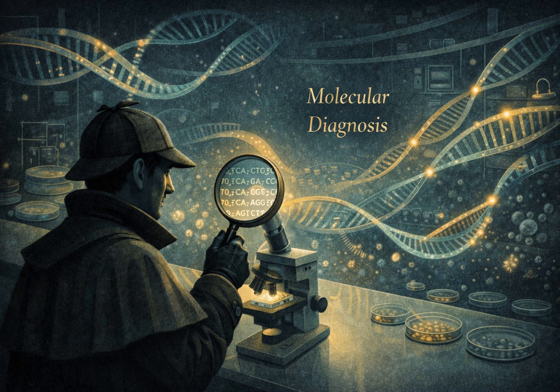And Jawetz also mentions its use for Candida, differentiating the common Candida albicans from some of the more drug-resistant non-albicans species like Candida auris. It's all about getting actionable information with speed and precision right when it matters most in critical care. Okay, so to sum up this first part, probes are great for finding a target if you have a lot of it, like in a colony or a positive blood culture.